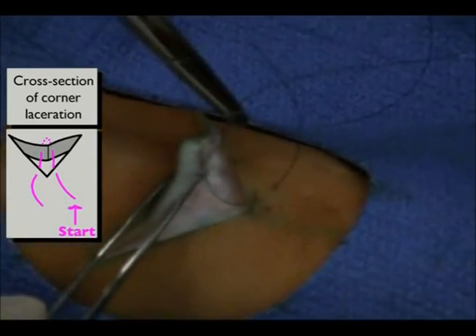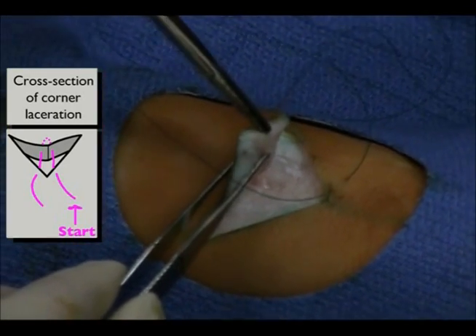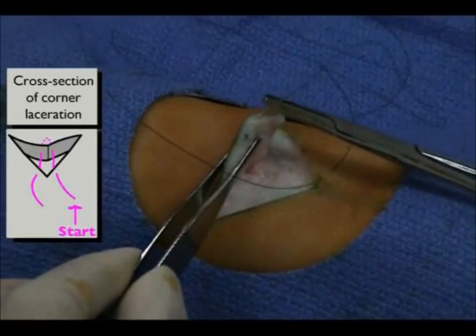Next, insert the needle entering and exiting the tip of the triangular flap only in the subcutaneous layer, being sure that it is at the same depth at which you exited earlier. Failure to do so will cause the flap to be at a slightly uneven level from the rest of the wound.